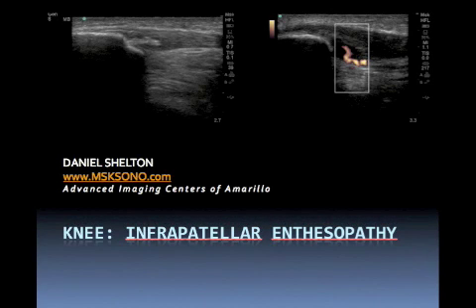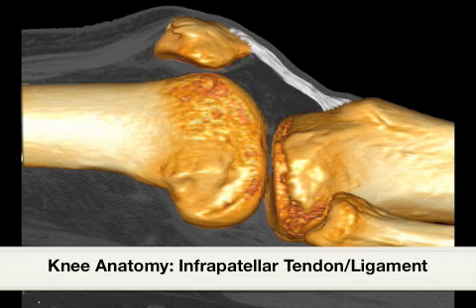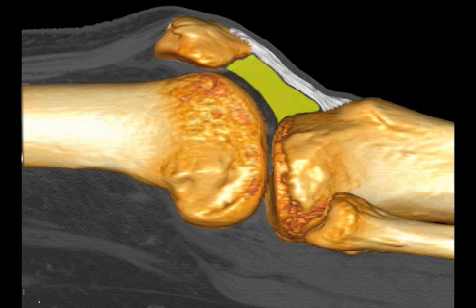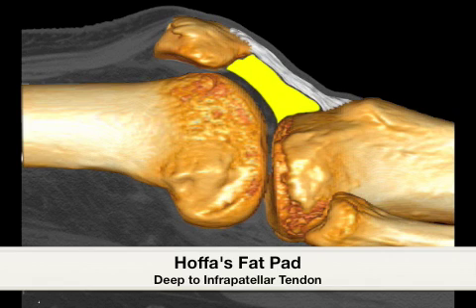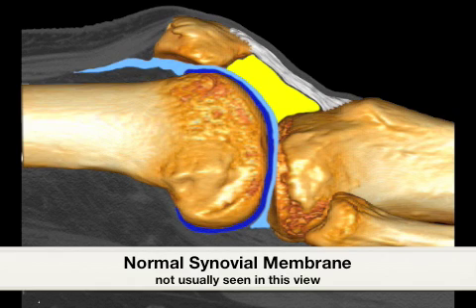In this video, we have a case study involving diffuse calcific tendinosis of the proximal infrapatellar tendon. The anatomy demonstrated in this picture includes the white infrapatellar tendon, the yellow Hoffa's fat pad, the blue articular hyaline cartilage surrounding the anterior surface of the femur, and in light blue, the normal synovial recess — the suprapatellar recess.